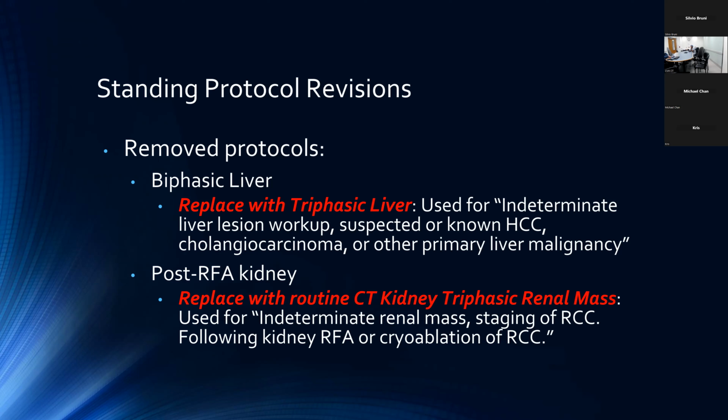It's actually one of the reasons that we're removing the protocol: it's really just not being used all that often. And when it is being used, it's usually being used incorrectly. So in those cases where you do still see the biphasic liver protocol until it's removed, these should be defaulted to the triphasic liver protocol, which is otherwise intended for workup of indeterminate liver lesions.